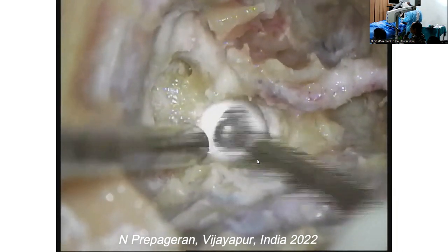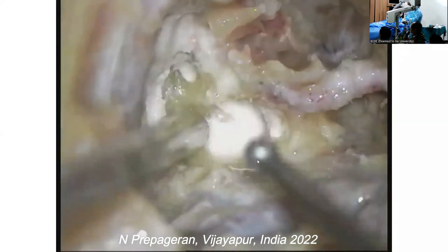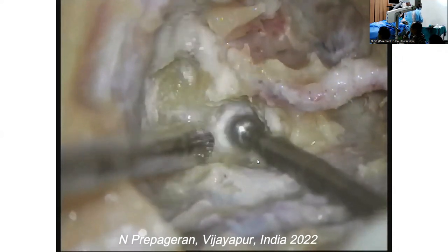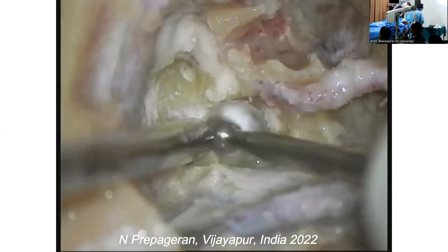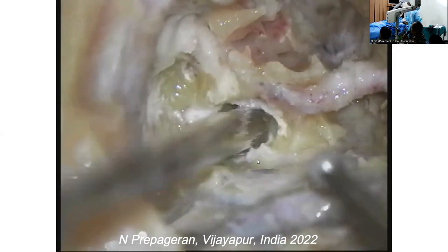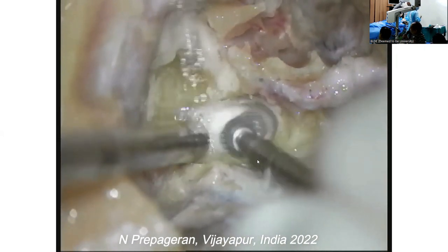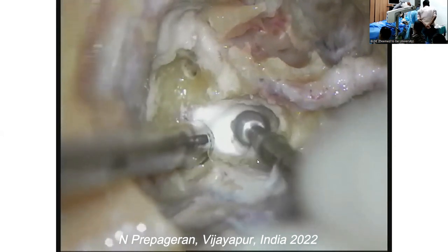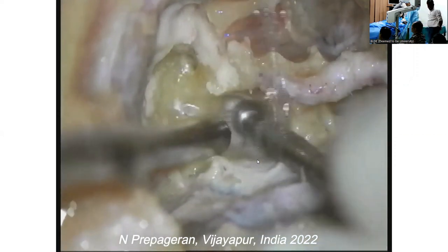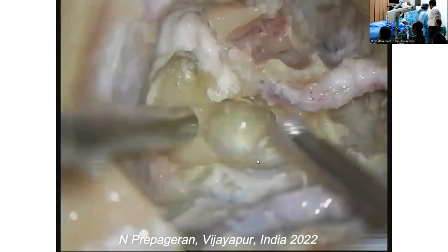It's too small. It should be bigger, no? If you have noticed, the vestibular component of the vestibulocochlear nerve, the fibrils are coming to the IAM from the utricle. So there's nothing here. When you do this for the first time, you wonder, my God, I'm drilling so much. But it's true. You drill a lot, so deep inside, but there's nothing here but the IAM.